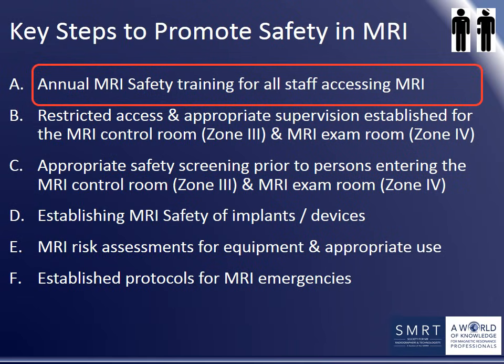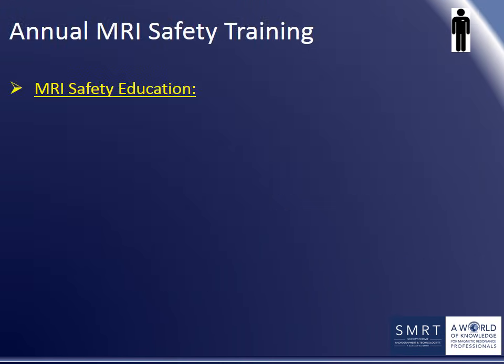There are a number of key steps we can all do to promote safety in MRI. We will now look at these individually, starting with annual MRI safety training for all staff working in or around the MRI environment.